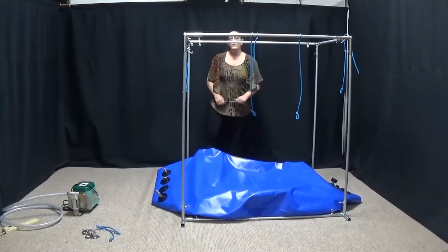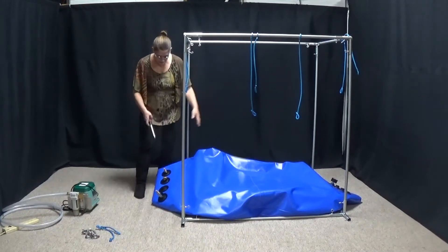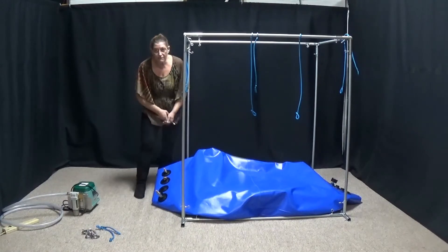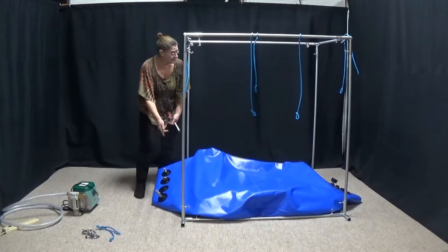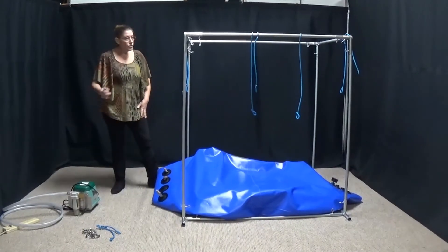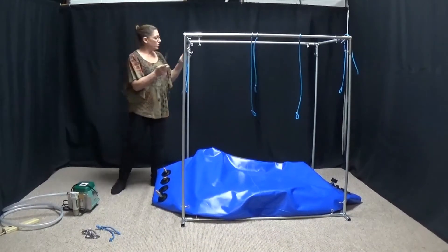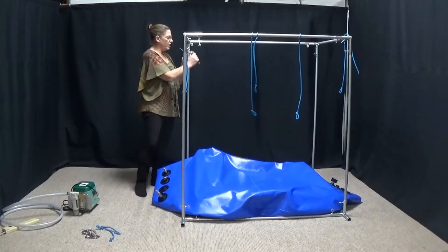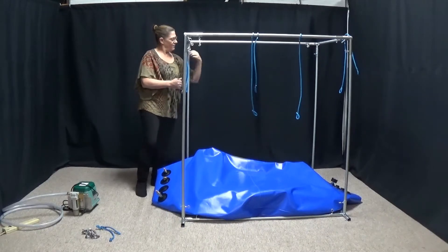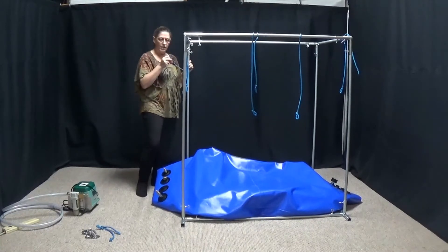Once you get the chamber inflated and everything's good, if you need to switch your valve so that the intake is on the other side because that's where your electric is, you can do that very easily by unscrewing this one and unscrewing the one over there — it's just exchanging them. Your frame should be nice and tight. If it's a little rickety, you can use your screwdriver to come in and tighten these up a little bit more.